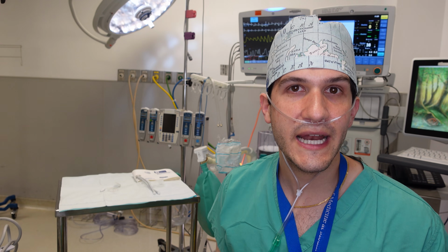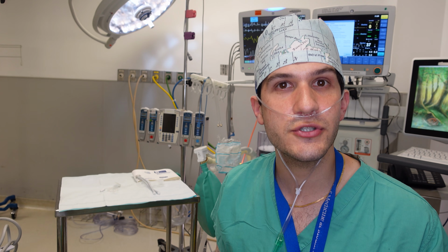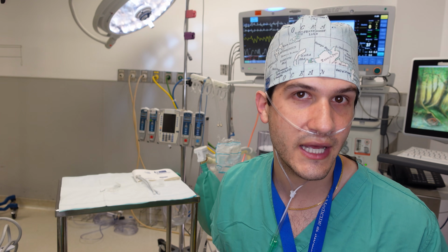For the sake of me not having to cannulate my own radial artery and also being able to keep my job, I'm going to show you what non-invasive blood pressure monitoring looks like, which is essentially what you're used to seeing at a doctor's office.